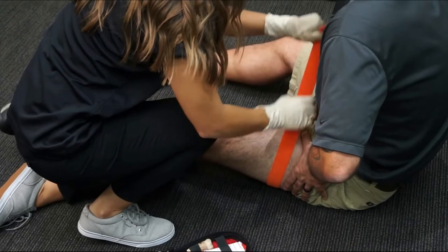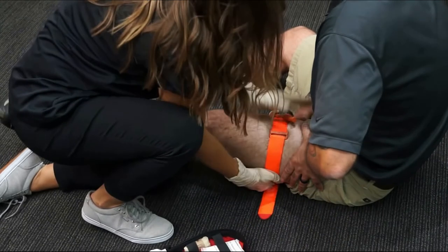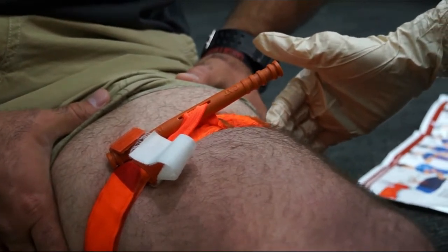Pull the band tightly and fasten it back on itself, all the way around the limb, but not over the rod clips. The band should be tight enough that the tips of three fingers cannot slide between the band and the limb.